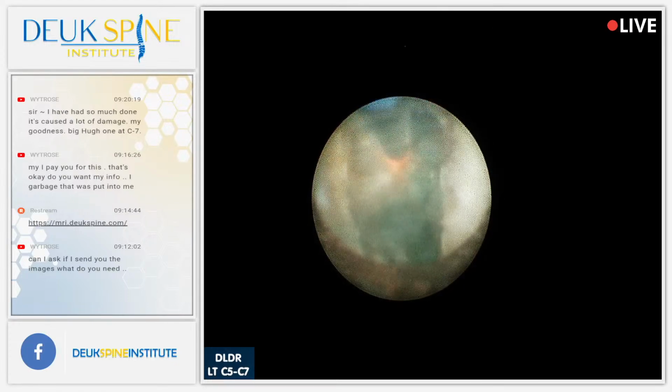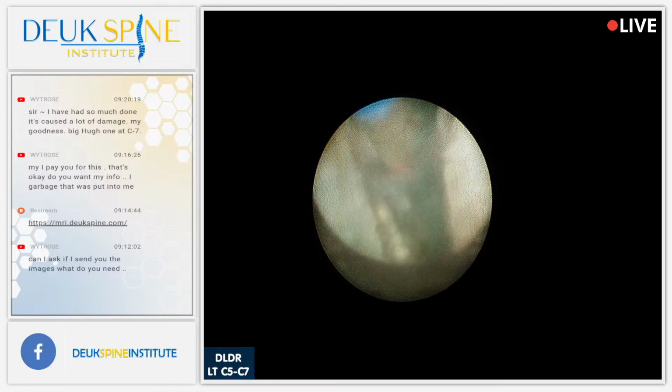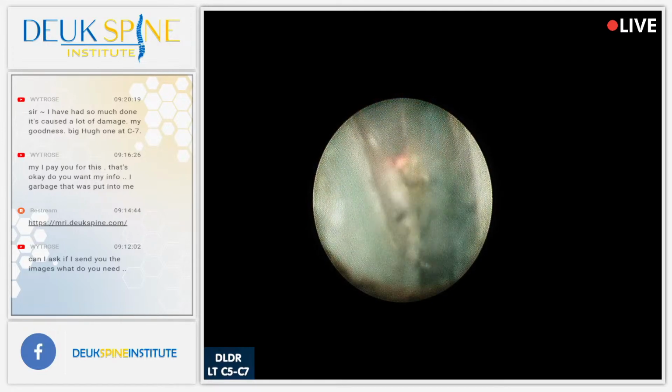All right, if there are no more questions, let's go ahead and show our audience what we are doing down here with the Deuk laser disc repair. How does this work?